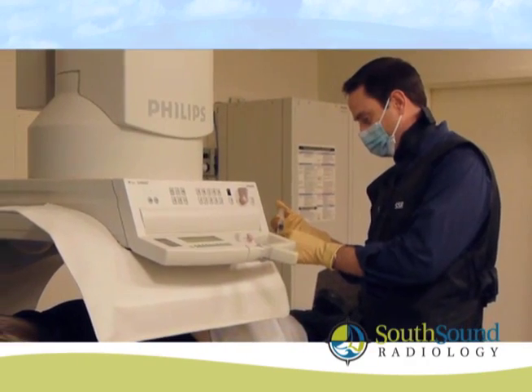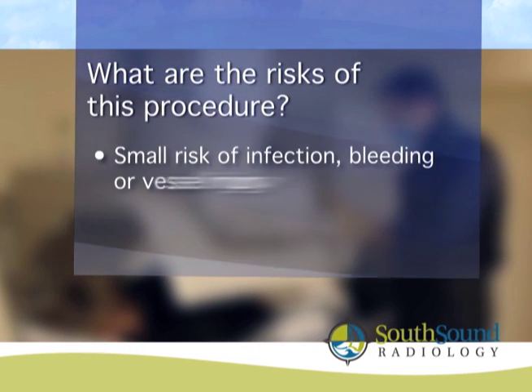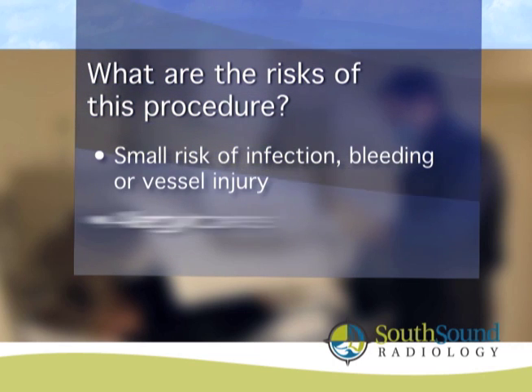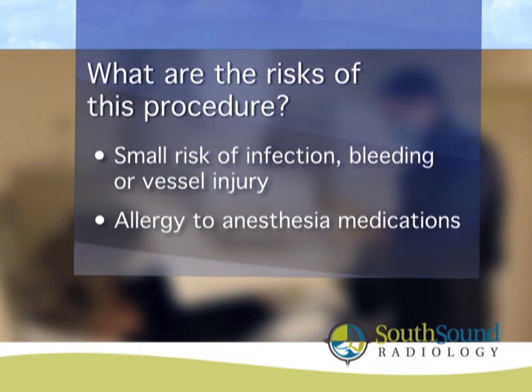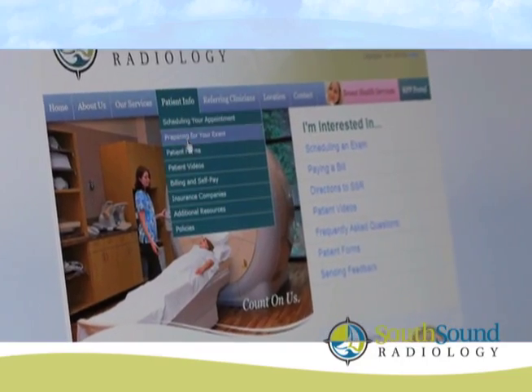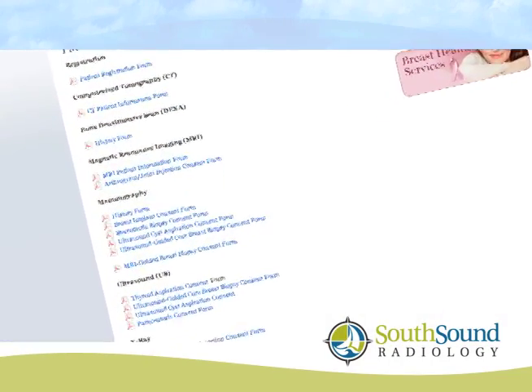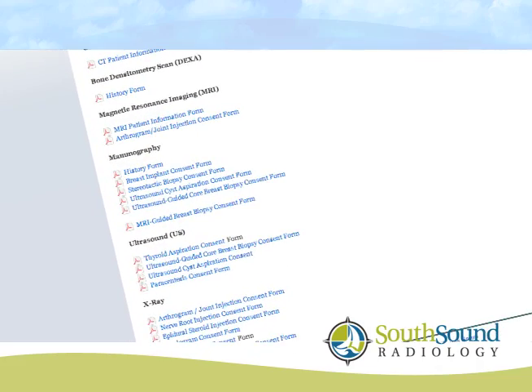Because we are breaking the skin's barrier, there are minor risks, including but not limited to infection, bleeding, vessel injury, or allergic reactions to the medications used. To ensure you understand all potential risks, please review the procedure consent form found at southsoundradiology.com under Patient Forms and discuss your questions or concerns with the technologist.